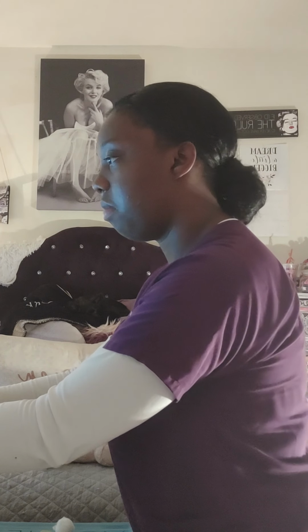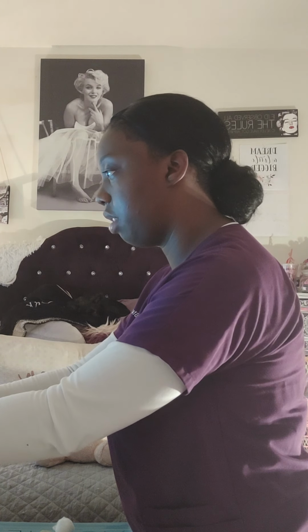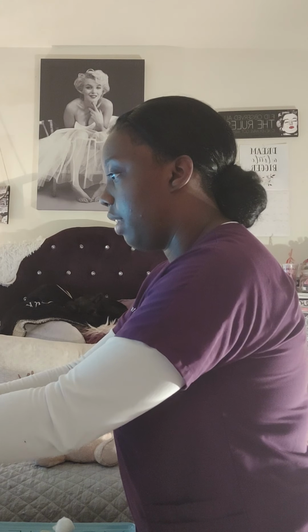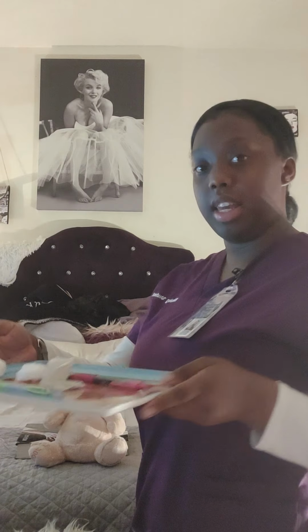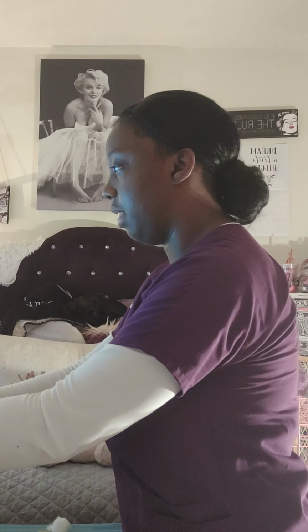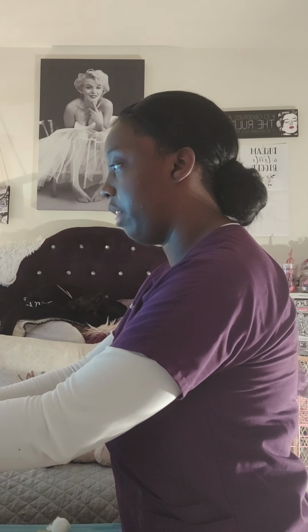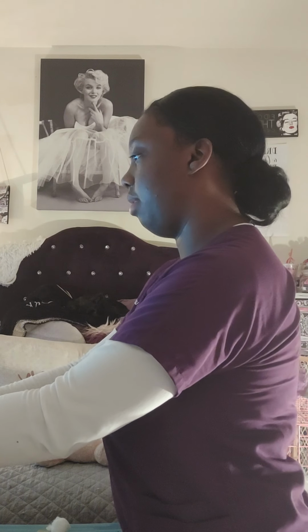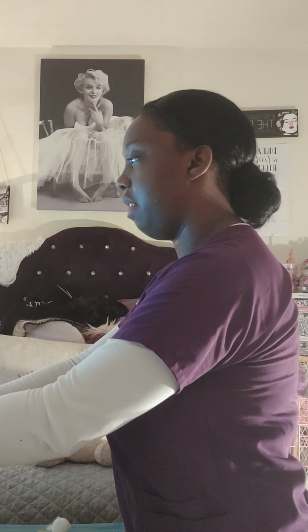Alright. And then the very last injection that we are going to be doing for our patient is called a subcutaneous injection. Now let's start from the beginning. We have the medication near the bedside. We're accessing her medical record, and while I'm doing that, I'm going to verify her name and birthday one last time. Sally George. The birthday is April 1st, 1995.